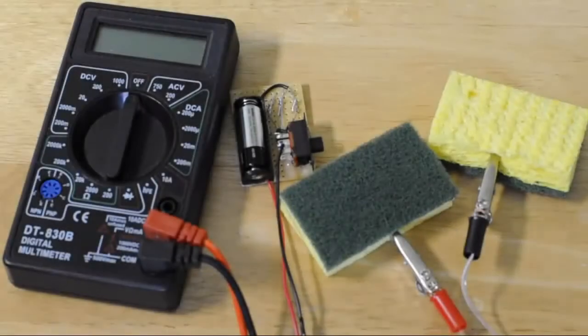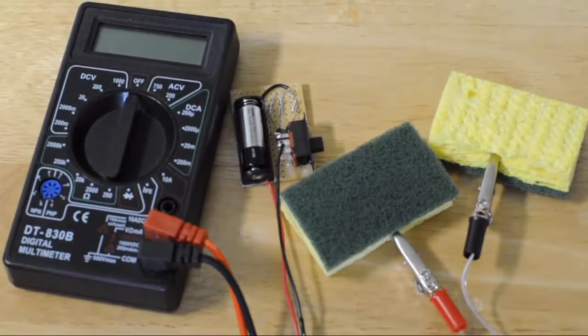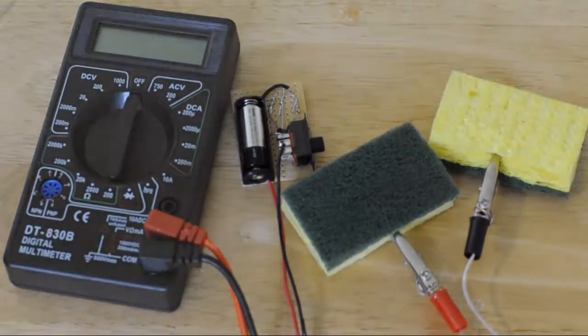Now it's time to measure the amount of electricity the TDCS device gives out so that we don't shock our brain with too much electricity. To accomplish this, we're going to use a multimeter.